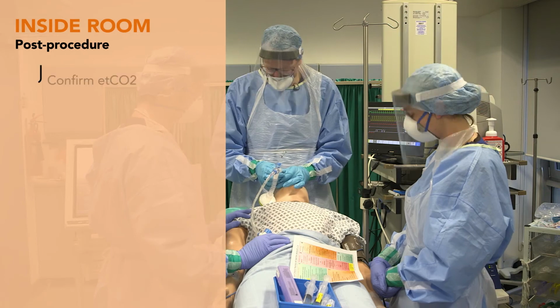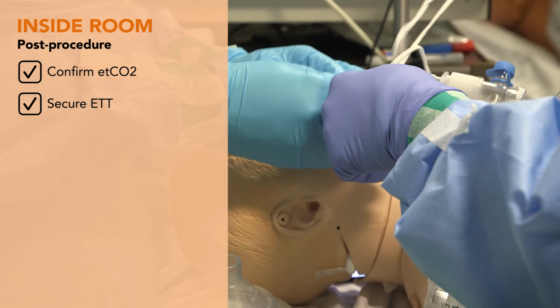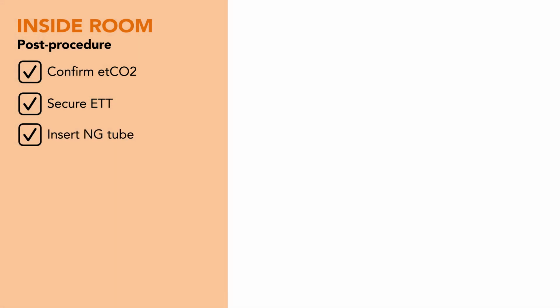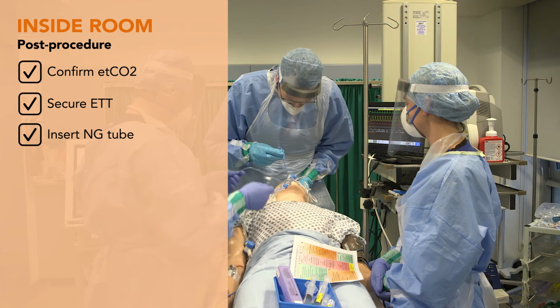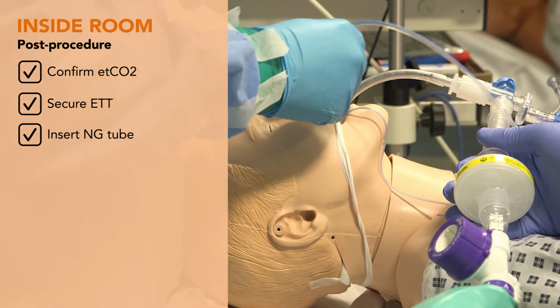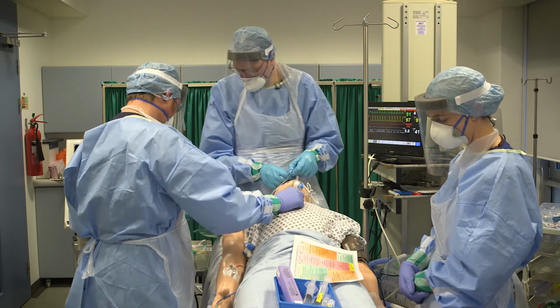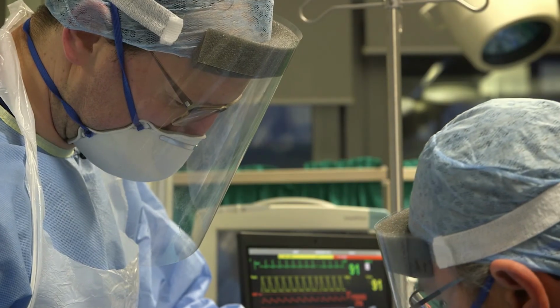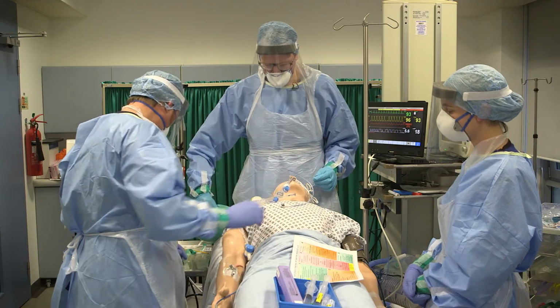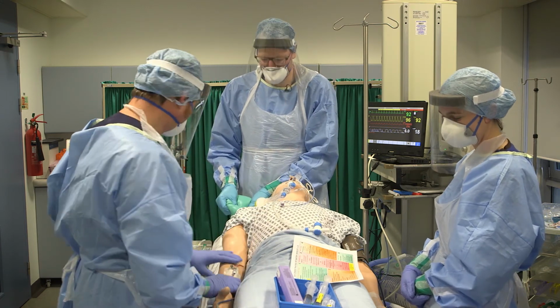Okay, so if we could secure the tube, it's at 20 centimetres at the teeth, and we're also going to place an NG tube. Thank you. Okay, if we could secure that at 64 centimetres at the nostril. Okay. All right. So now we're going to proceed to transfer to the ventilator.